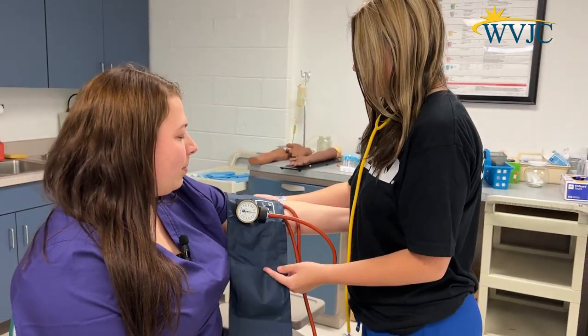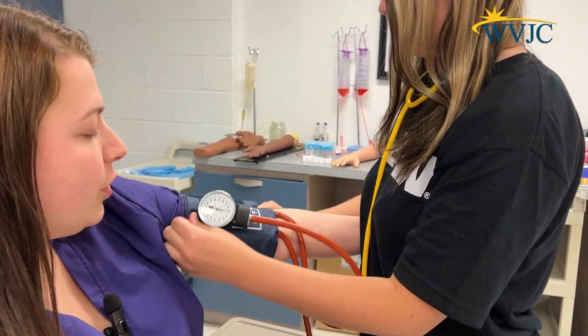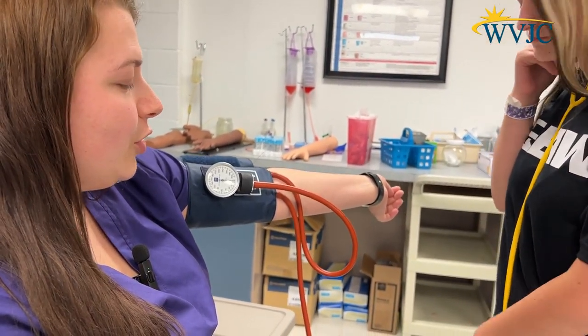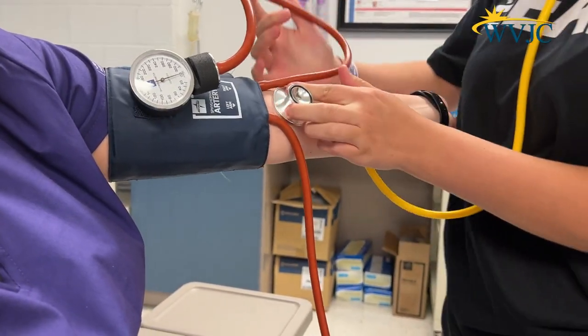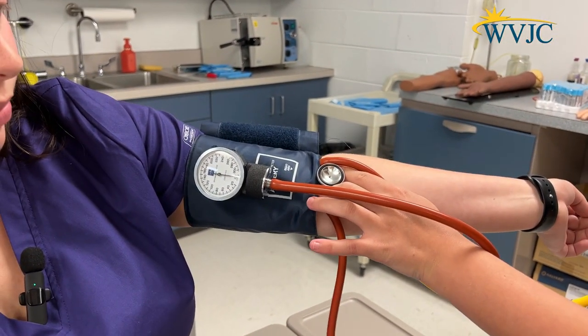She's going to wrap the blood pressure cuff around my arm and check if it's too tight or too loose, making sure it's on my main artery. Then she's going to take the stethoscope and put it on my main artery, and then pump it up.